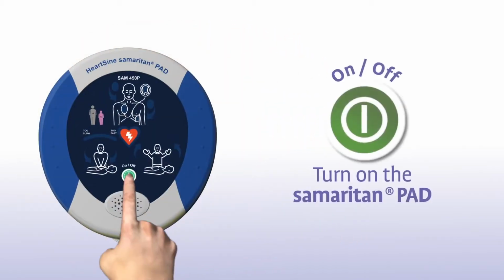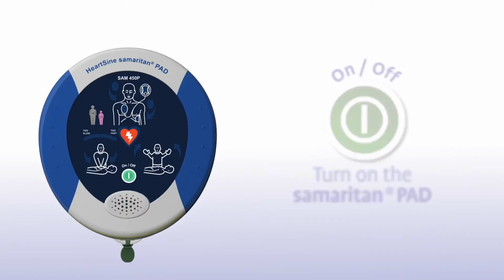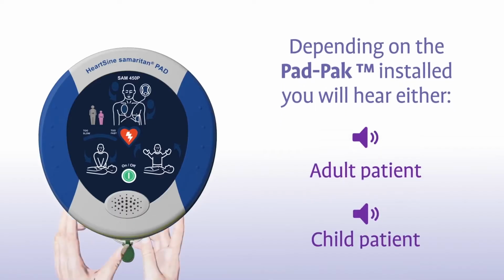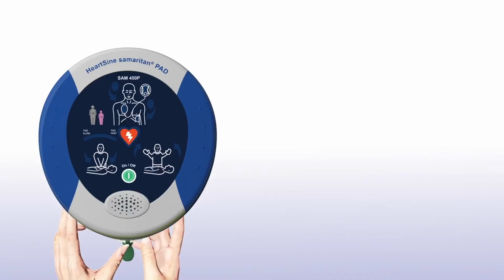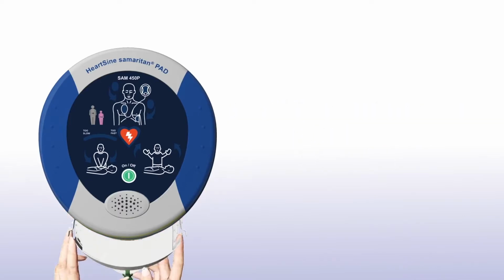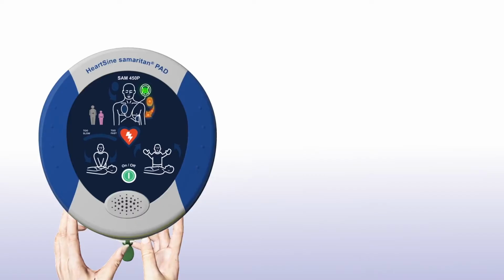Press the green on/off button to turn on the Samaritan PAD. Depending on the pad pack currently installed, you will hear either an adult patient or a child patient prompt. If the patient is a child between 1 and 8 years of age, you should ensure a pink pediatric pack is installed. If a pink pediatric pack is not available, you may use the grey adult pad pack instead.